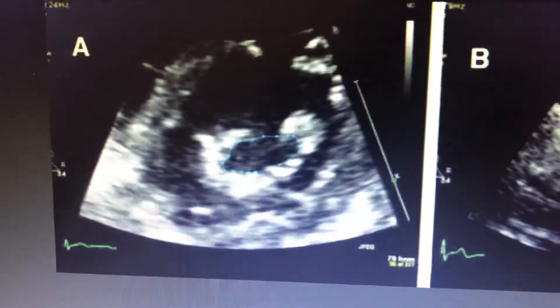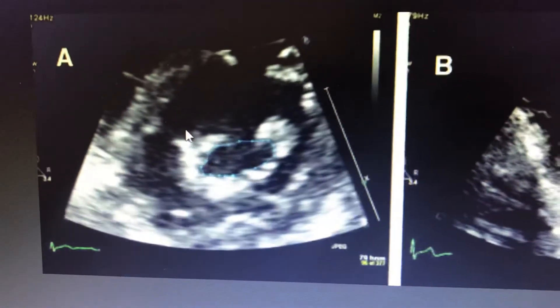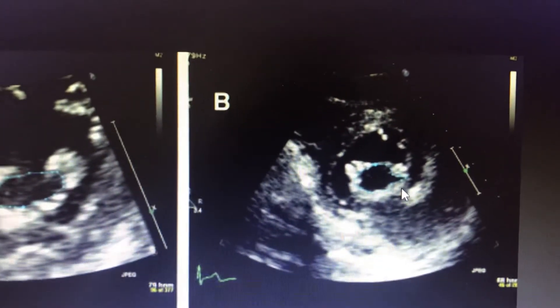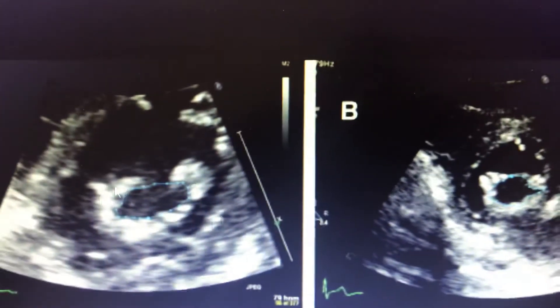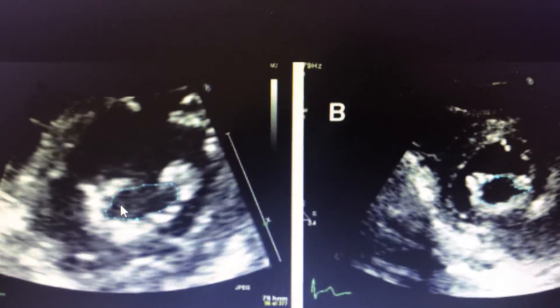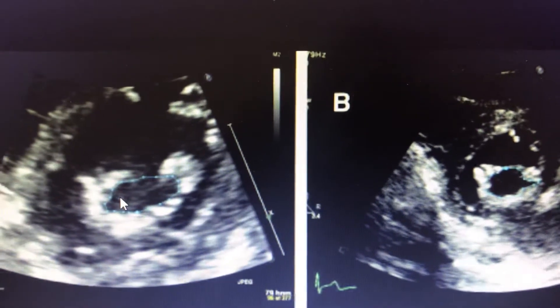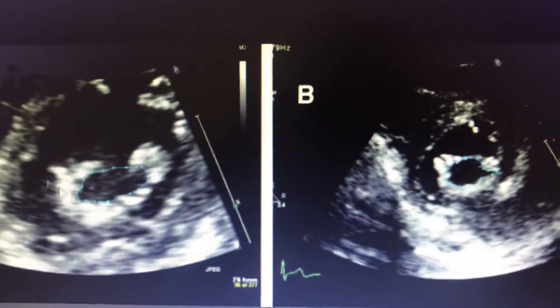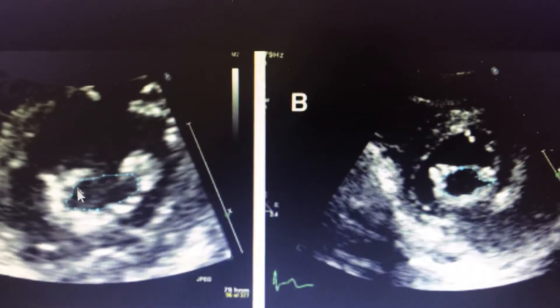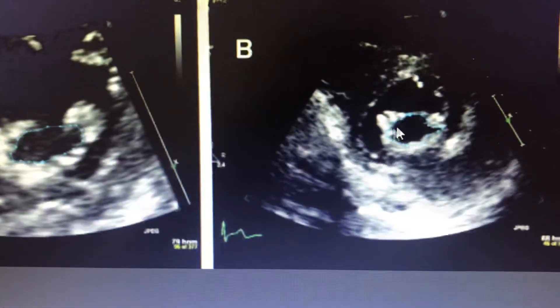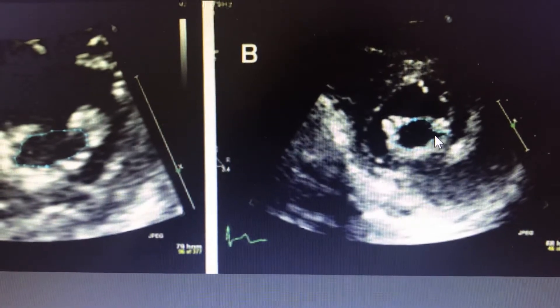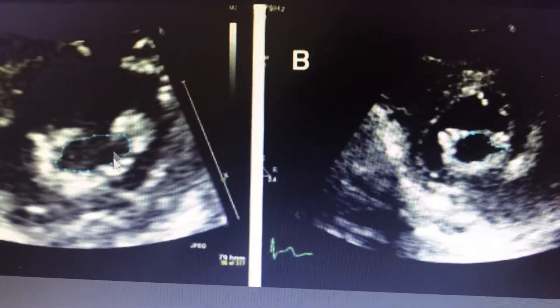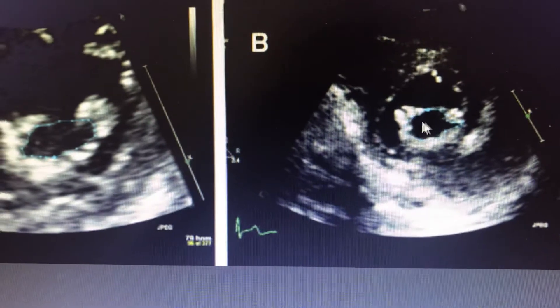We have here the short axis view of the mitral valve taken in the 2D echo, and you can see that it is in diastole. The mitral valve in the short axis — both views will be taken in the diastole, not in the systole.